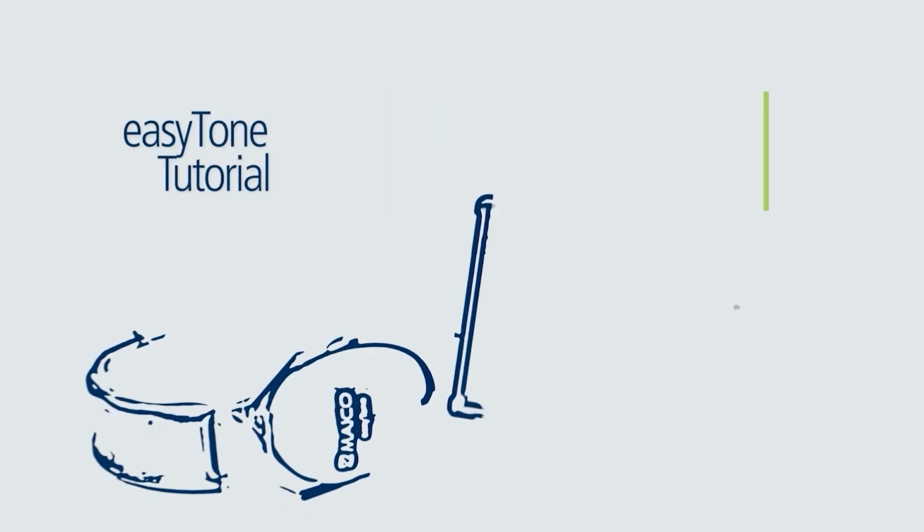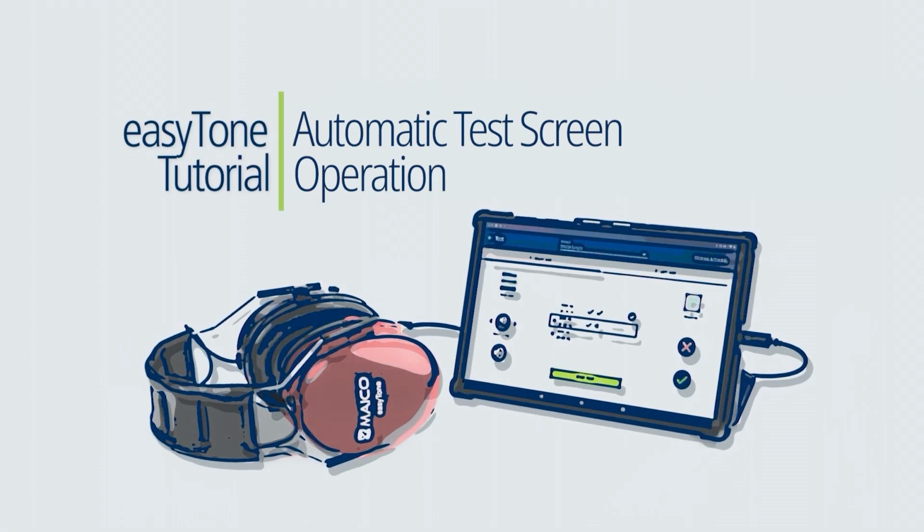This completes the tutorial on automatic test screen operation. Please continue through the tutorial series for additional easyTone instruction.